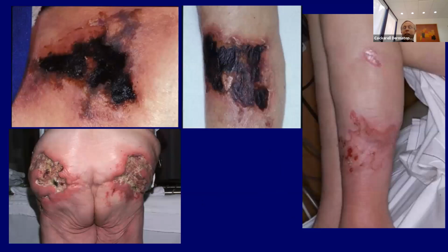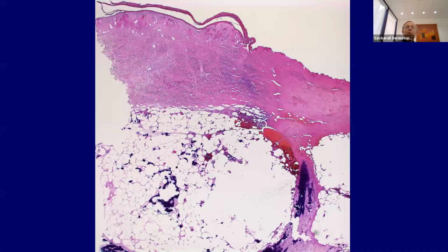So again, these are the kind of clinical manifestations that you can see with this. Notice that retiform purpura here due to the overlying necrosis and ischemia that's developing. Another example of that over here, and then these ulcers here. These often get secondarily infected, they get septic, and it's just one thing leads to another, and they often end up dying from this. So here, everything above this is just necrotic, degenerated collagen, eschar. It's sort of analogous to a burn.